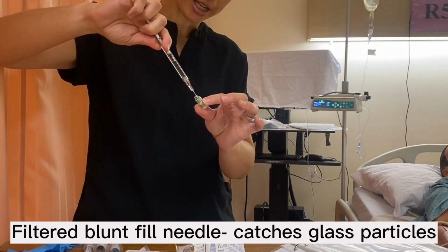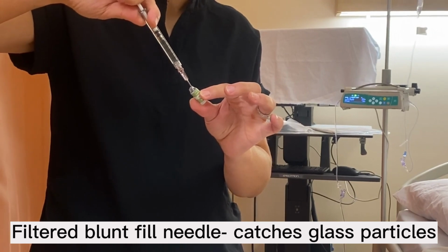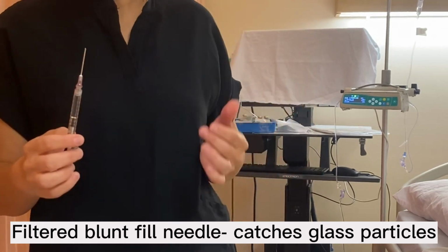Okay, and I'm going to pull back a little bit more, and you're going to see why in a minute. So just slightly more than 0.5. Okay. Now I would discard this, but I would want to get a waste, so somebody to waste that with me because it is a narcotic.